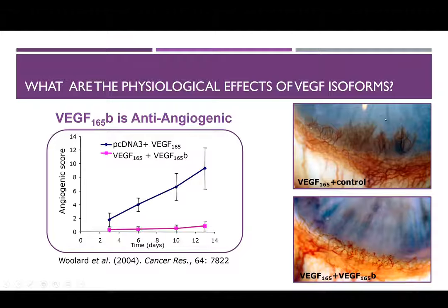And so if you put in equal amounts of cells into a little slit made in the cornea up here, and then waited a little bit, over a course of 2 weeks nearly, what I can hope to convince you of is that you can see that there is a growth of blood vessels that are starting to migrate and move to where that slit was made. So where the pro-angiogenic isoforms were implanted into the rabbit eye, you can see that there is quite a robust pro-angiogenic response, even within the scleral tissue below.